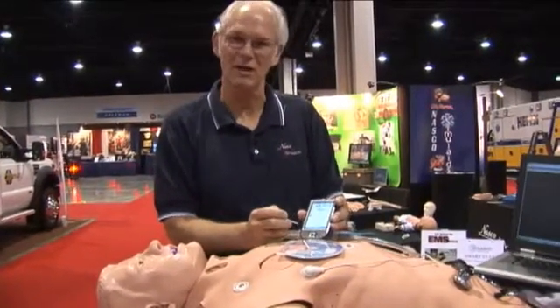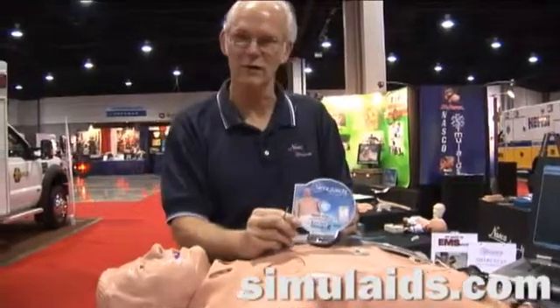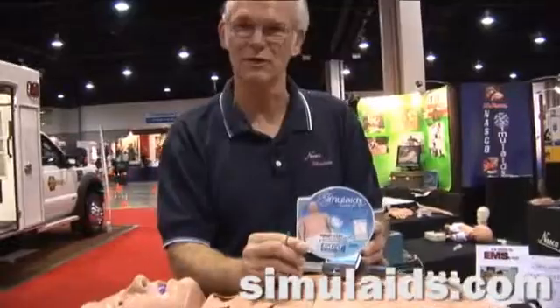So come see us. Stop by our website. You can also request a free movie on SmartStat that will take you through the entire process.